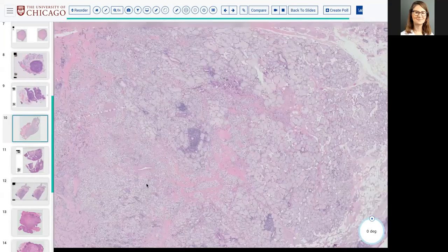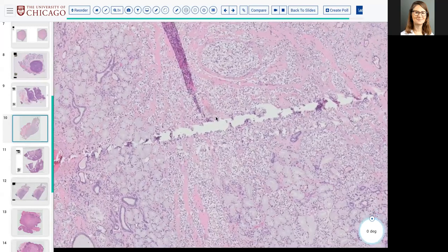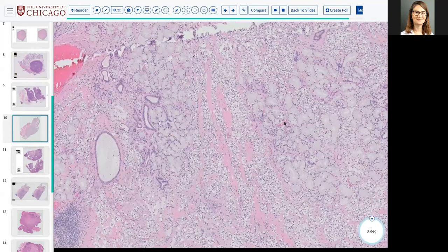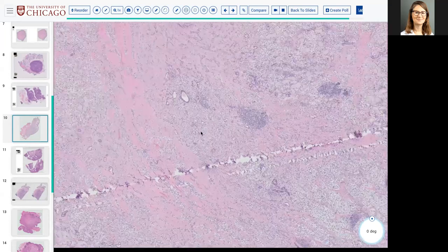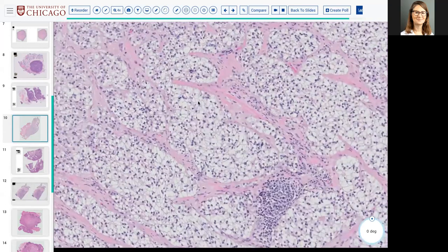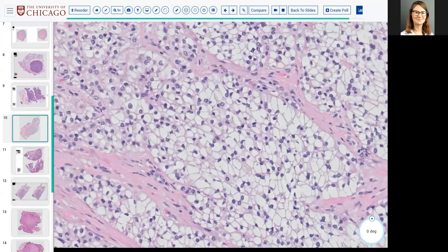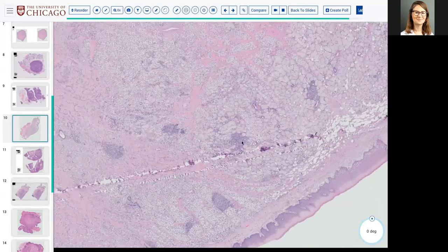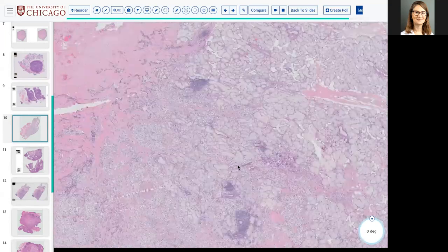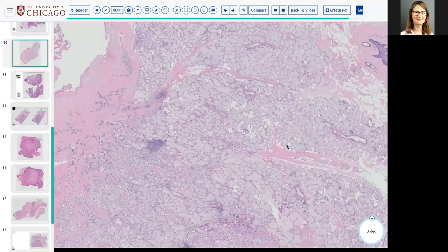So this is a textbook example of clear cell carcinoma, formerly known as hyalinizing clear cell carcinoma, but they got rid of the hyalinizing because it doesn't always hyalinize. And for that matter, it's not always clear. Sometimes it can be pale eosinophilic, but in its classic form, yes, it has these very water clear cells with collagenous membrane material in the background. Exactly, clear cell carcinoma, with these wrinkled nuclei. And the two points I'll make about this is, often you can see these in minor salivary glands, just like polymorphous, right? We tend to see them in minor salivary glands, especially the palate. This is also a palatal case.